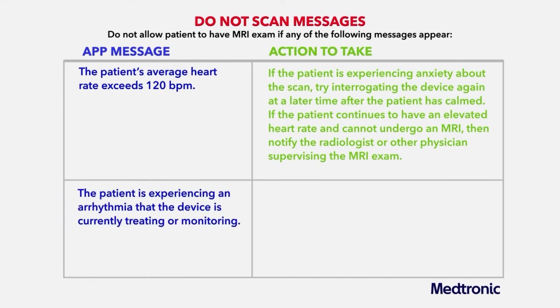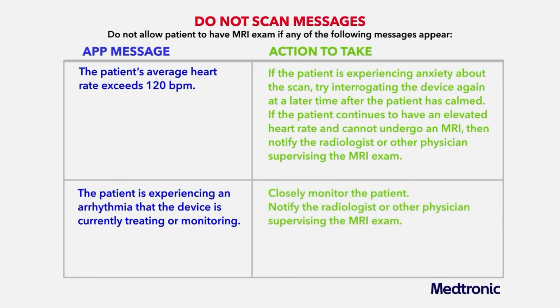If the patient is experiencing an arrhythmia that the device is currently treating or monitoring, then you should closely monitor the patient and notify the radiologist or physician who is supervising the MRI exam.